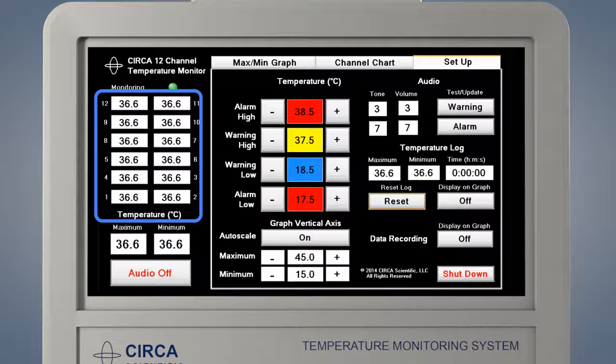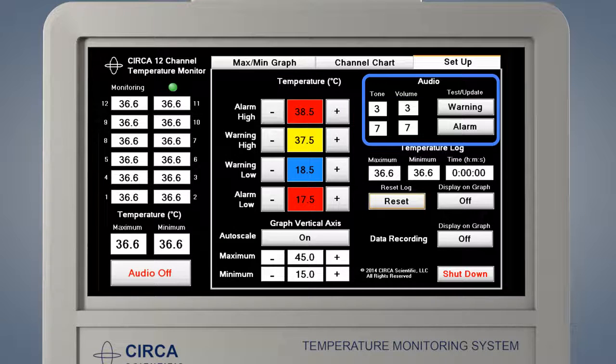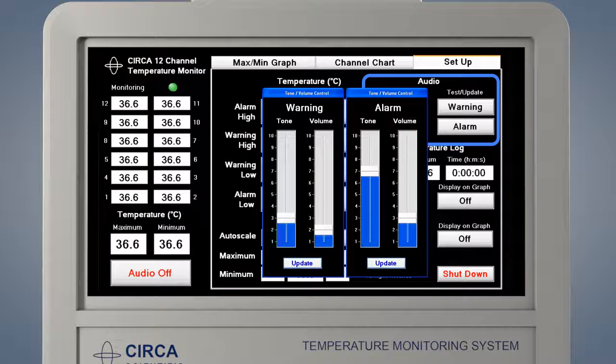From this screen, you may also set warning and alarm limits and adjust the volume, among other functions. The monitor is also shut down from this screen. To adjust the warning and alarm limits, use the plus and minus buttons to change the values. The high warning limit must always be lower than the high alarm limit. The low warning limit must always be higher than the low alarm limit. To adjust the volume of the warning and the alarm, press either the warning button or the alarm button — a pop-up slider will appear. Drag either the volume or the tone with your finger. When the setting is at the desired level, press Update. Please note: the warning volume may be set to zero and will then be silent. The alarm volume must always be higher than the warning volume and cannot be set to zero.